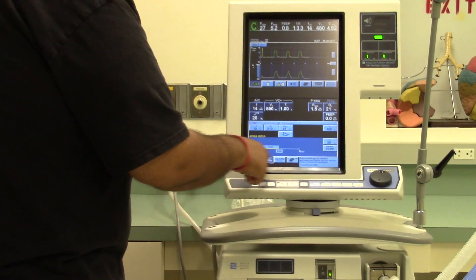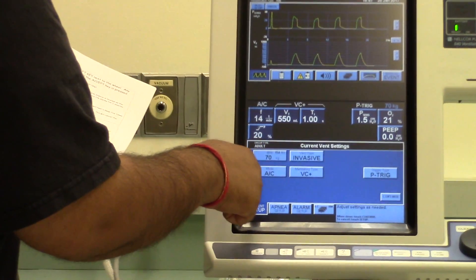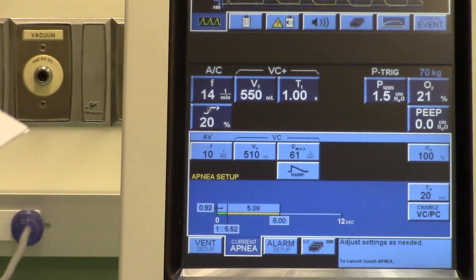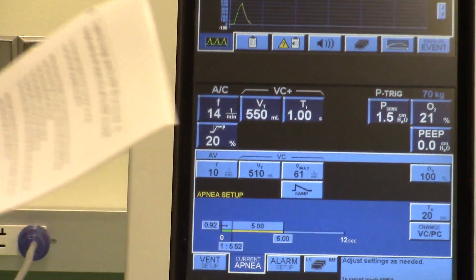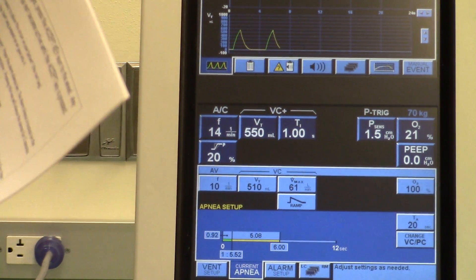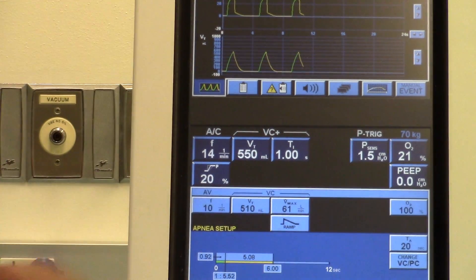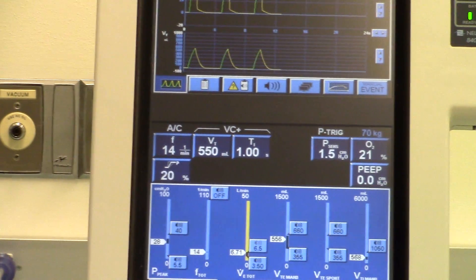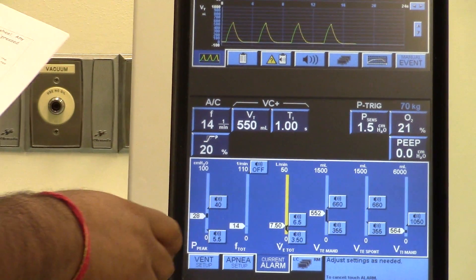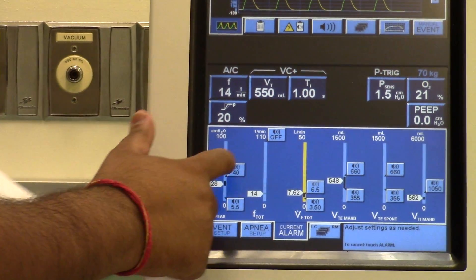We have our settings here — the vent settings we could change, and the apnea settings. If the patient does not take a breath for 20 or more seconds, the ventilator will alarm and begin ventilating the patient with the apnea settings. For our alarm settings: our high pressure alarm we're going to set at 35.